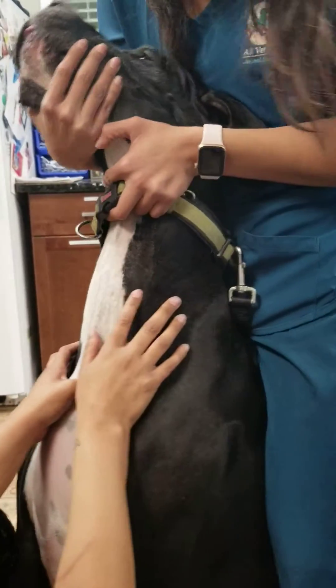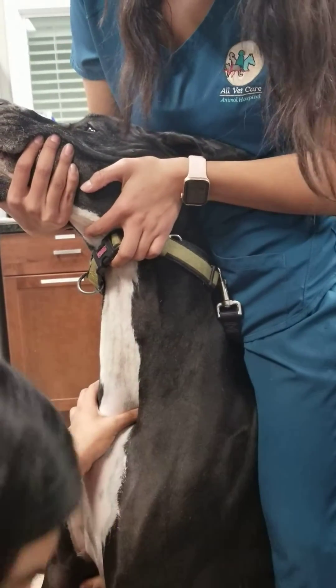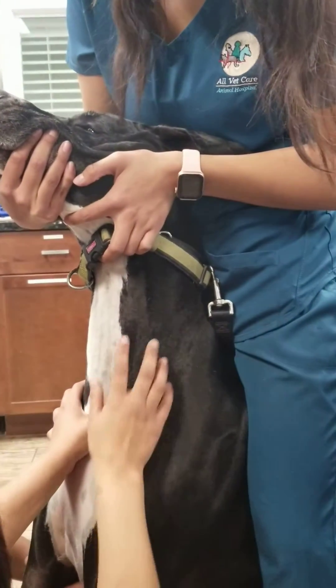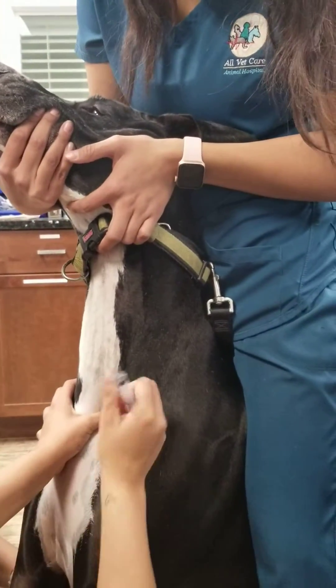As you can see, she's pushing down on the thoracic inlet to stop the blood pressure, to be able to see the jugular a little better. I'll place an alcohol before we go ahead and stick the needle in.